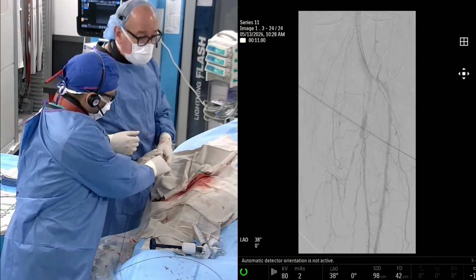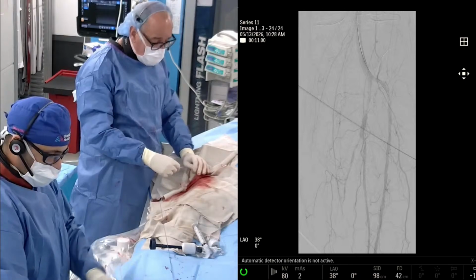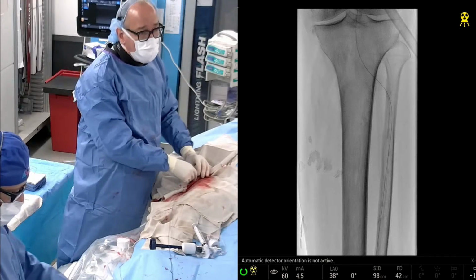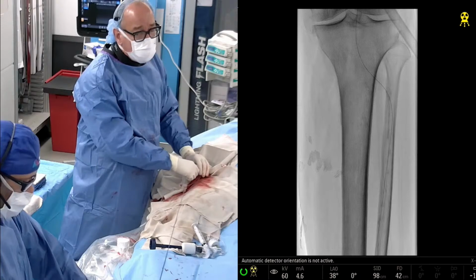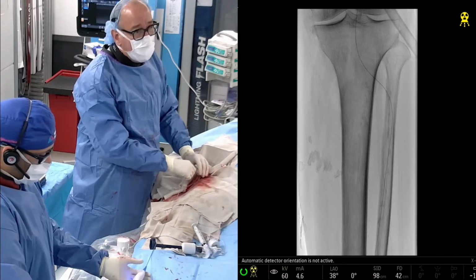Most conspicuously, this is not an electrical based IVL platform. It's a laser based IVL platform. And so the IVL is really activated by laser energy being transmitted into the balloon once it's inflated to create the pulsations. And then there's a couple of very nice features that I'll go into in just a minute.